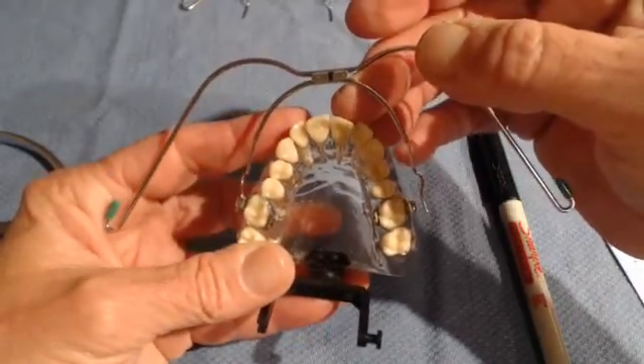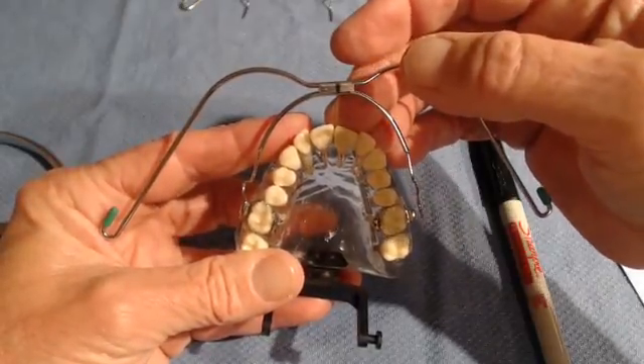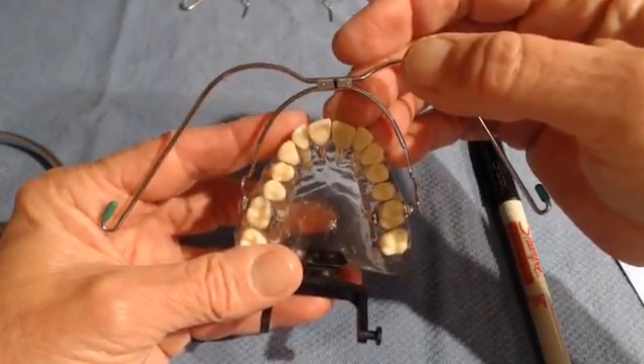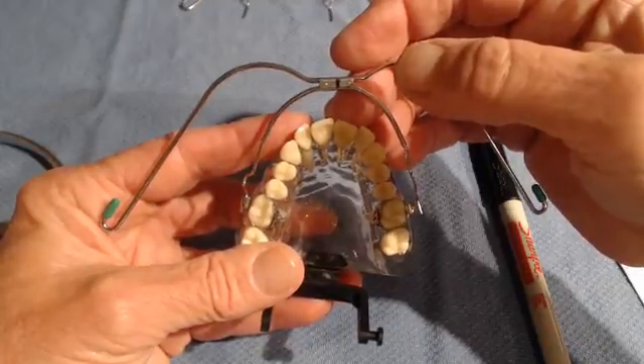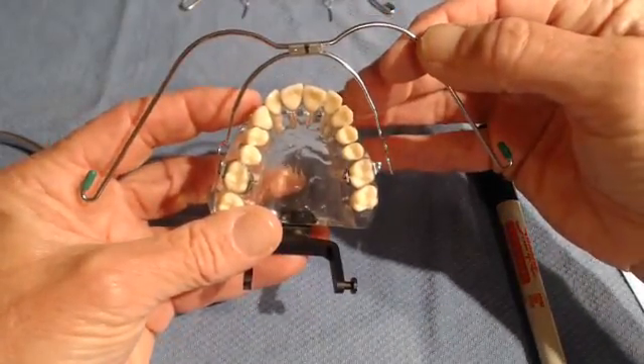I'd also like to make a disclaimer here: this is not POS philosophy that I'm discussing — this is how I do my headgear delivery. So again, it's Jeff Taylor talking, not POS. Next, consider what the expansion is in the arch.